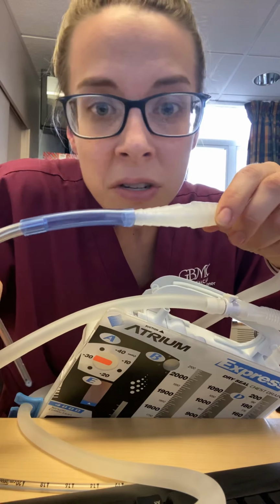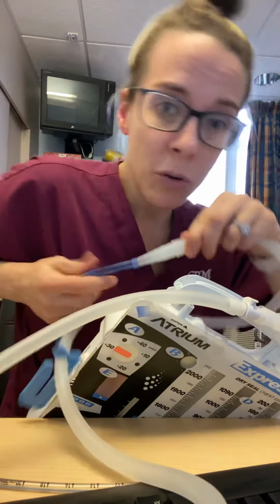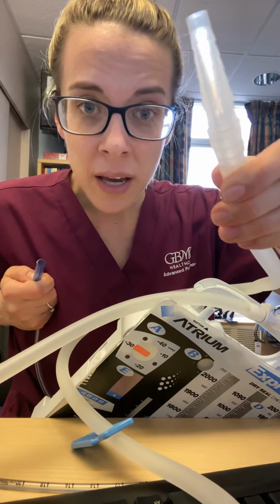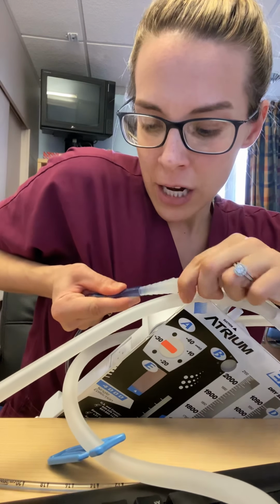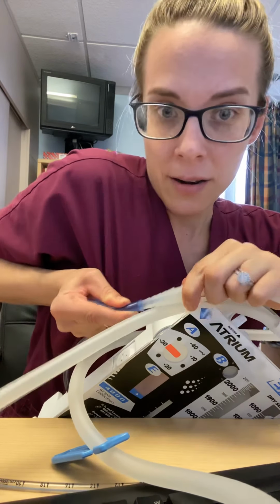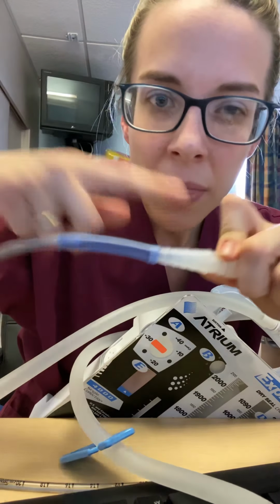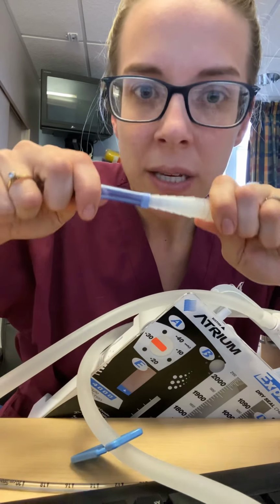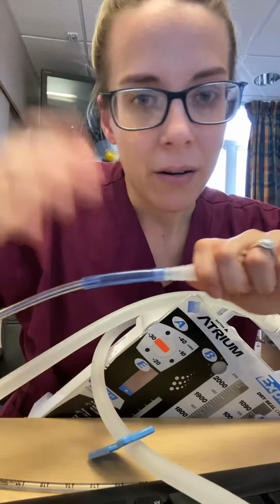So let's say the nurse calls you in the middle of the night that the chest tube became disconnected. The patient was moving, and boop, it became disconnected. You would pick up this piece, look for the edge of the chest tube outside the skin, and literally just put them back together. Like that. Sometimes you'll even see people tape around this, but the surgeons I worked with didn't really like that because then you can't visually see that this is a secured connection. So I don't know, everybody's different.